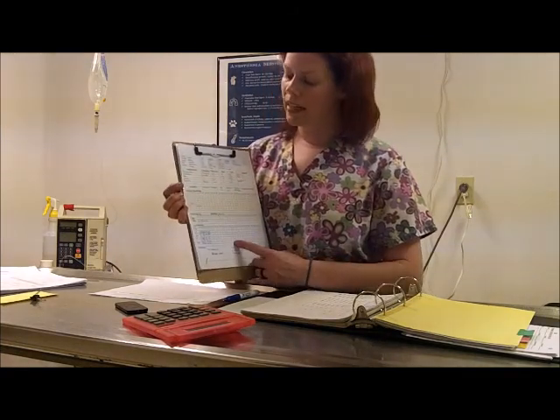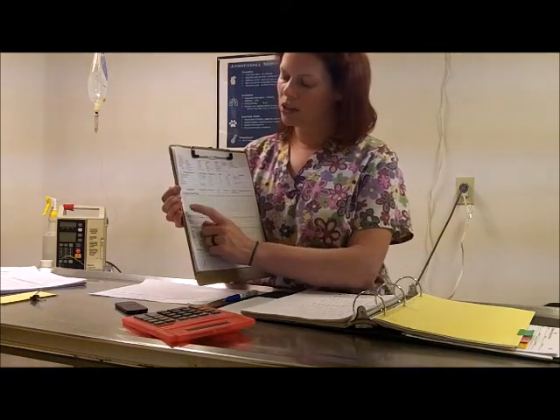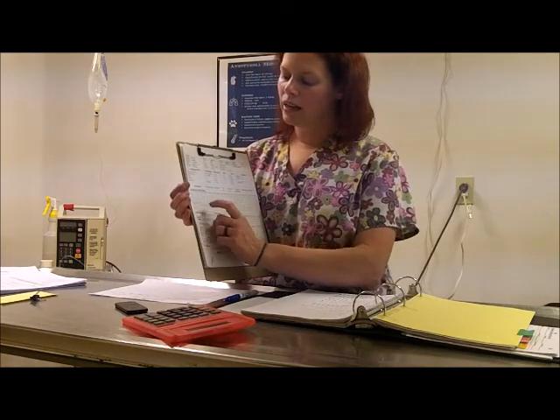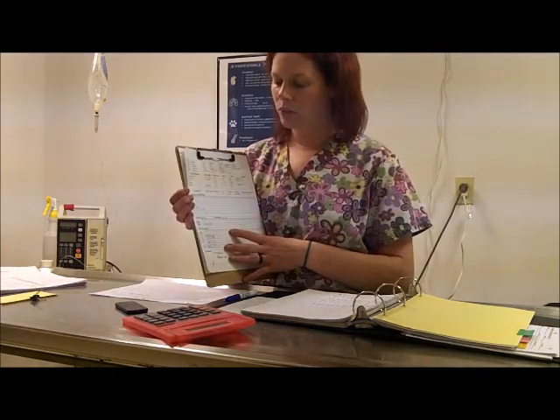The next section is our anesthesia monitoring, which is the vaporizer setting throughout the procedure. It is marked in 5-minute intervals, starting with a 0 to 8%, so whether or not you're using, in this case, isoflurane or sevoflurane. And again, it is marked every 5 minutes. This way you can see the trends of how the pet handled anesthesia, ideally trying to keep them at the most adequate plane of anesthesia throughout the procedure.